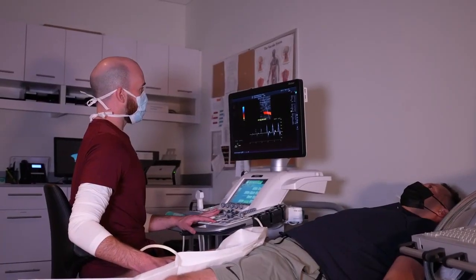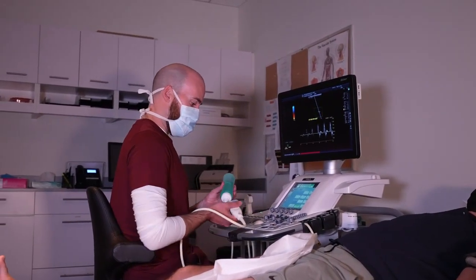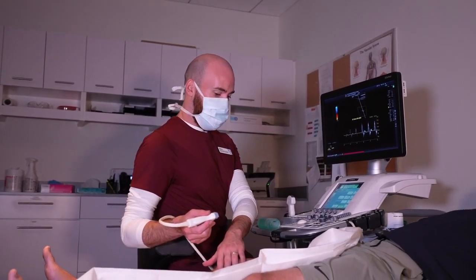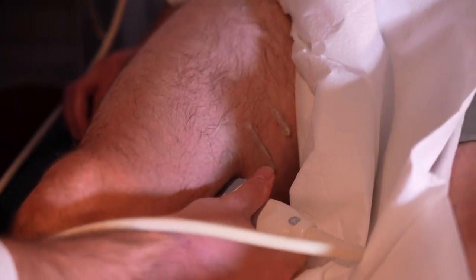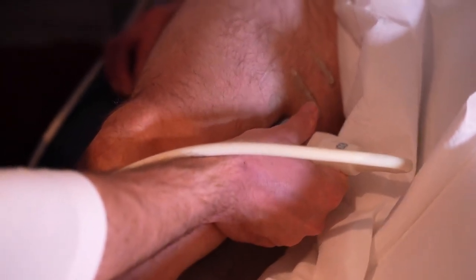The majority of our tests are actually performed on the legs, and it's for patients who've got pain when they're walking, numbness, tingling, cold sensation in their legs, or non-healing wounds. So we perform an ultrasound scan looking directly at the blood vessels in real time to assess for any narrowings or any blockages. And our vascular interventional radiologists will do a really detailed written report.